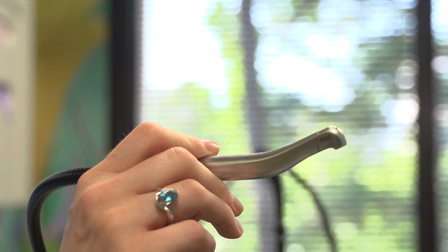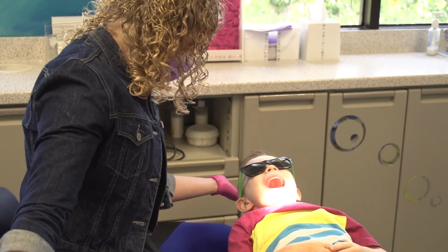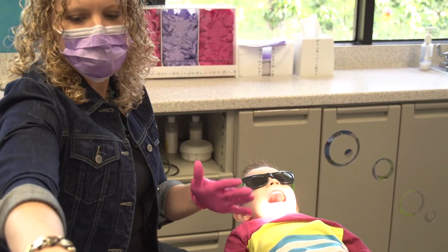So the whole rest of the tooth still retains normal sensation, which as a dentist is a dream, because at the very end we ask people, anybody who's had dental work knows, they ask you to bite on it so that we can tell, is your bite on, is your bite off? If you're all numb, are you really biting the way that you normally would? Probably not. But when you're not numb with the laser, you can get a really great accurate bite. So I almost never now have patients that need to come back for me to adjust their fillings just because they're able to bite well at the very end of it.